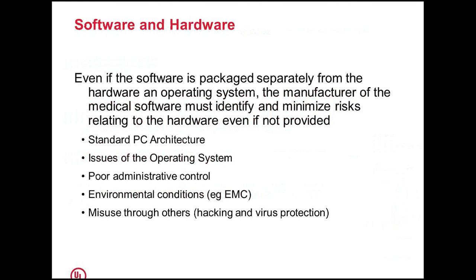How this software and hardware are interrelated. Even if software is packaged separately from the hardware as an operating system, for example the picture archiving and communication system, where it's only software which can be packaged separately, the manufacturer of that PACS needs to identify and look at the various means in which the device can fail due to the supporting hardware structure.